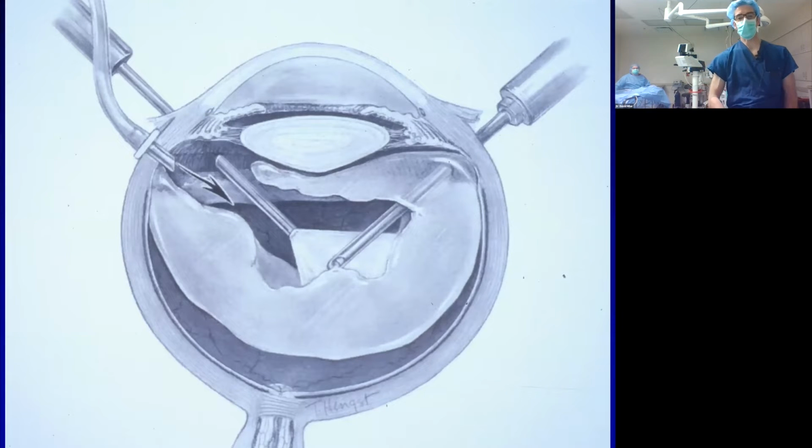Little illustration of how a vitrectomy is performed again. Infusion coming into the eye, light pipe, and the vitrector doing a core vitrectomy. In a phakic patient, this is the lens of the eye. Again, the pupil's up here.